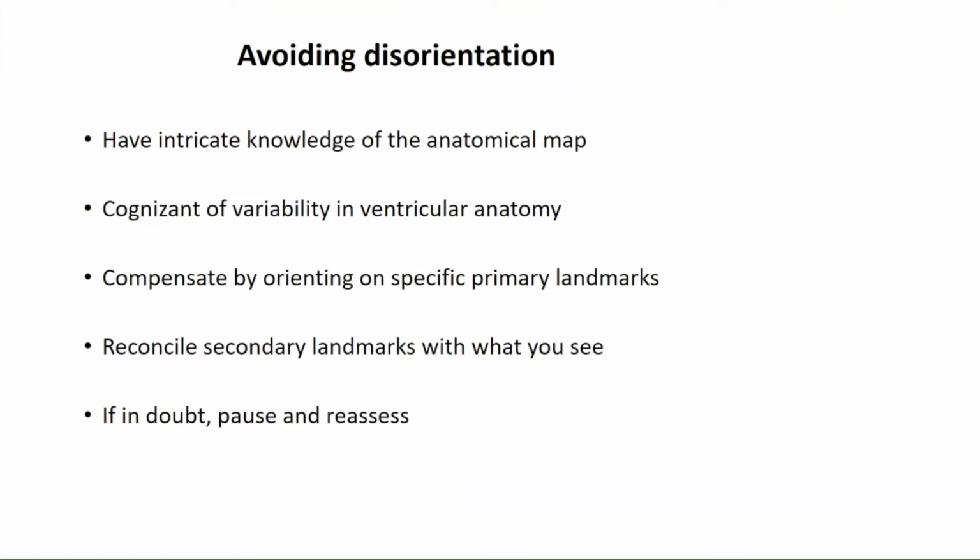Very importantly, especially for example in the earlier image that I showed, if you've just cannulated the ventricle, you're a long way off from making your ETV stoma, and you're still disoriented, stop. Don't just blindly keep going forward, because that's just going to cause problems.